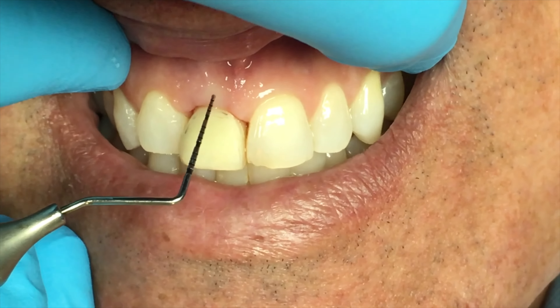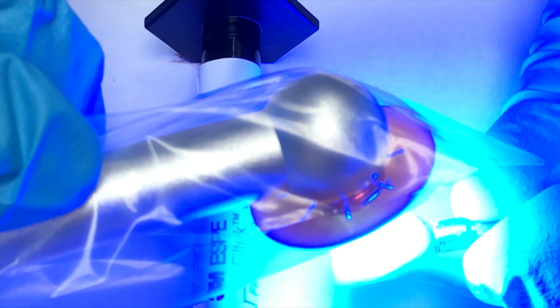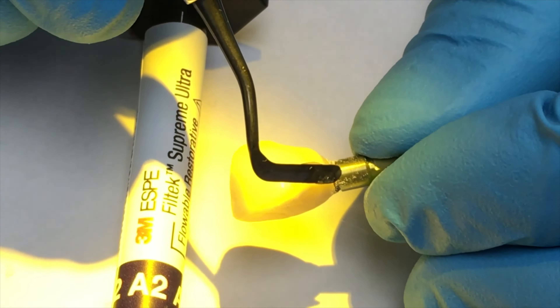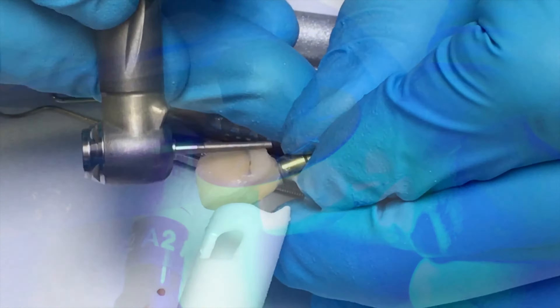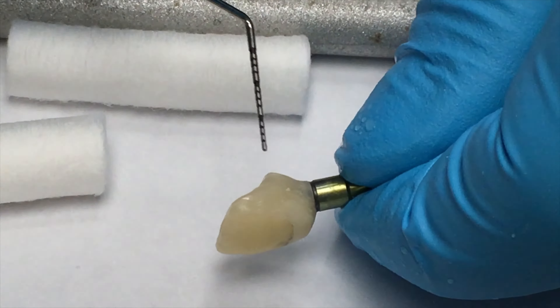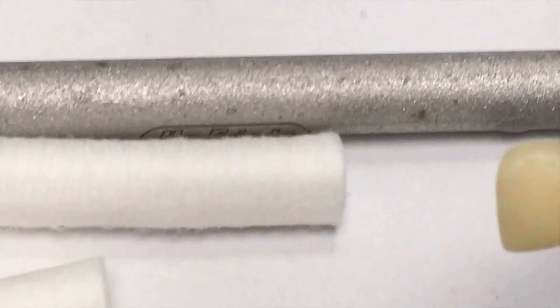The goal is to add more material here so the gum can come up a little bit. From the side you can see the amount that was added on this tooth. I'm going to polish it so I can see that it's enough.